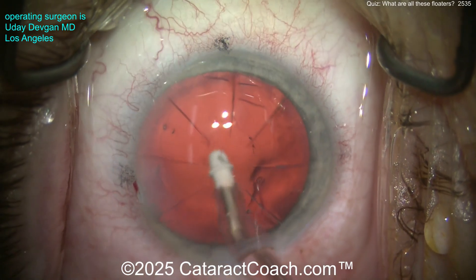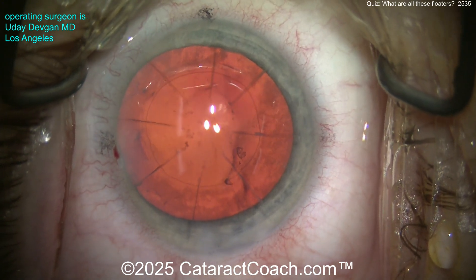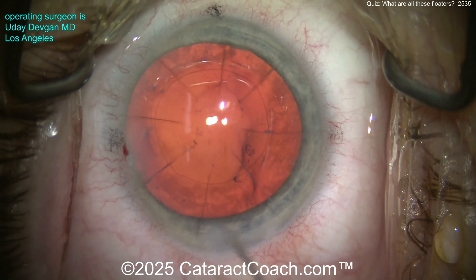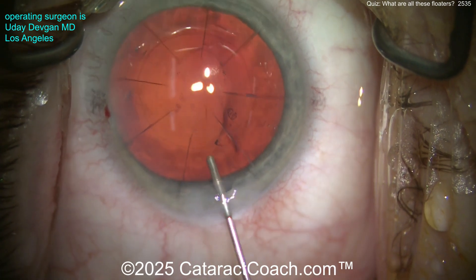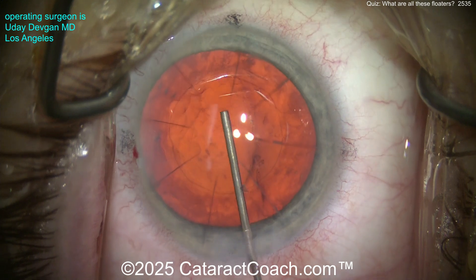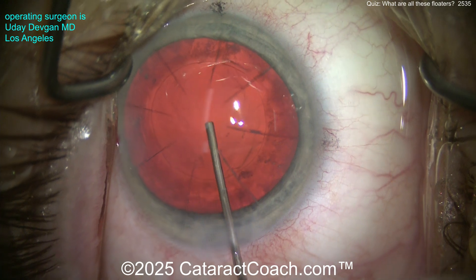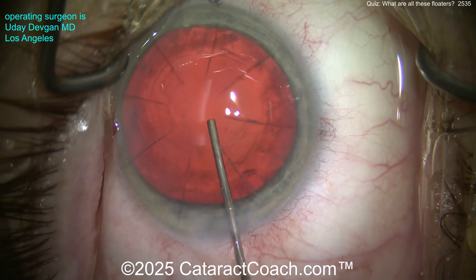Here's another case. You can see the radial keratotomy scars, so this was obviously formerly a high myope. Look at all the material in the anterior hyaloid — right in Berger's space behind the posterior capsule — you've got some lens material fragments. There's a little bit, though not much in this case. The rhexis turned out to be totally normal.